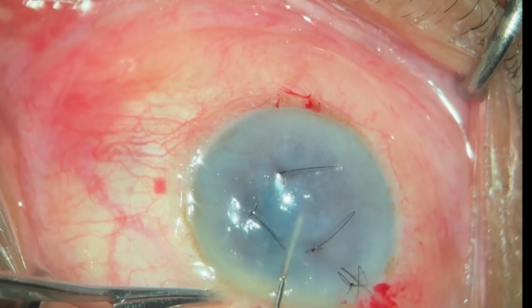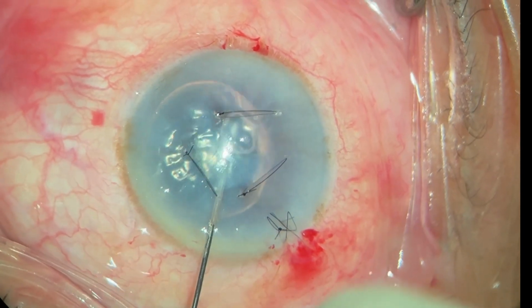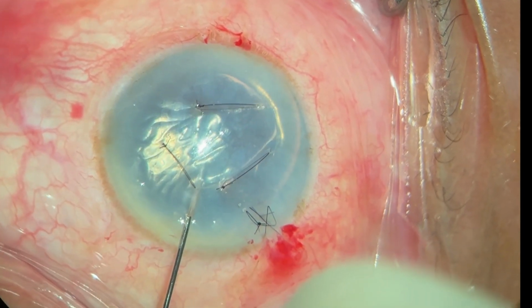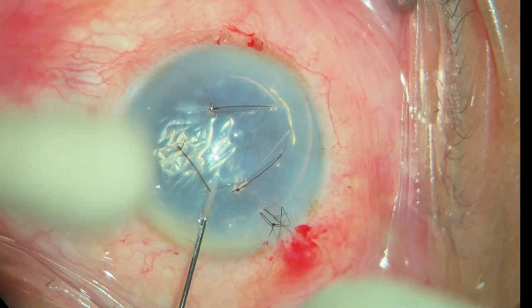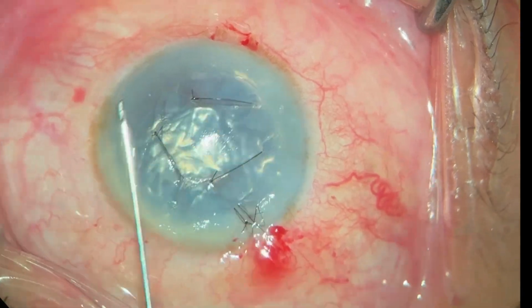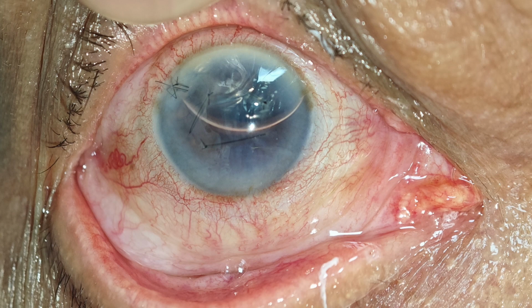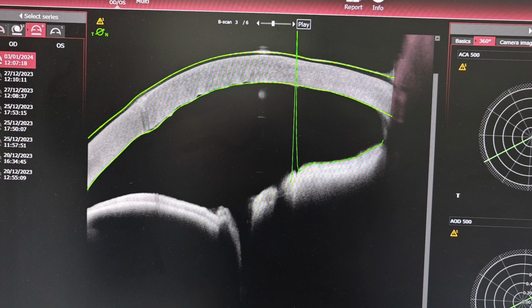Isoexpansile C3F8 gas was injected intracamerally and a full chamber gas fill was achieved with a well pressurized anterior chamber. Immediate postoperative examination on slit lamp showed around 80% gas fill with intact sutures. 2 days post-op showed around 40% gas fill with intact Descemet membrane on ASOCT.